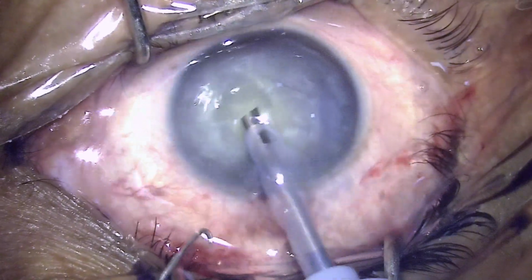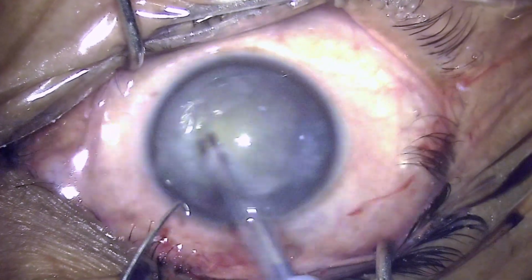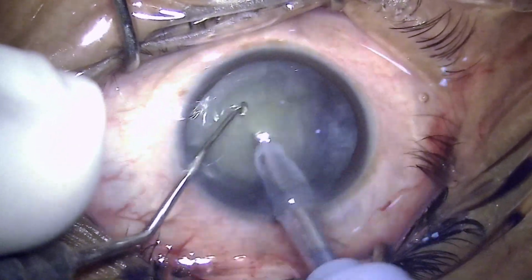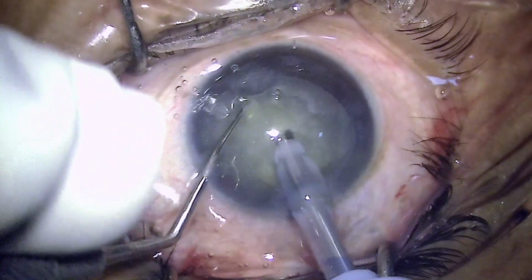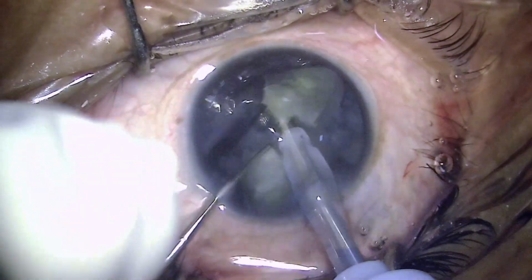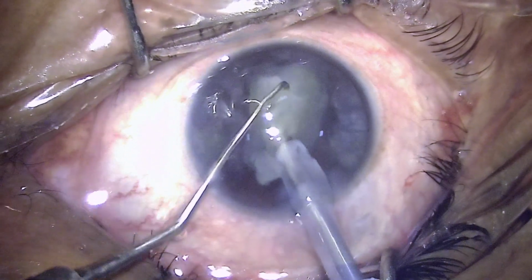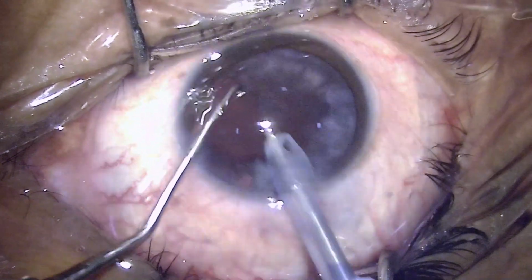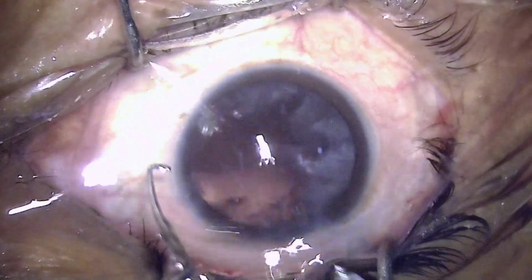Now rest of the surgery is not an issue. It's a white cataract with reasonably sized nucleus, removing the overlying cortex and then performing the primary chop. The video is being run at 1.5 times its normal speed because the point of interest was limited to performing that rhexis. At times the nucleus can be simply made to stand up, and that will provide ease of access and chopping in a situation where there may be a compromise in the anterior chamber depth.